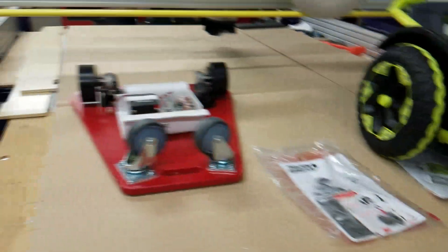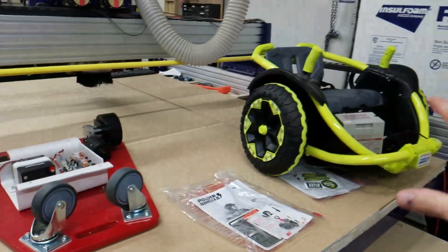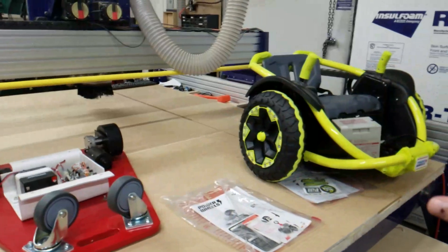We want to see if we can merge these two, because it's really expensive and time-consuming to create the power scooter from scratch. But if we can buy a unit like the Power Wheels and just put some of the parts in, we could save some time and money. So we've been working on that, and I'll show you where we're at.